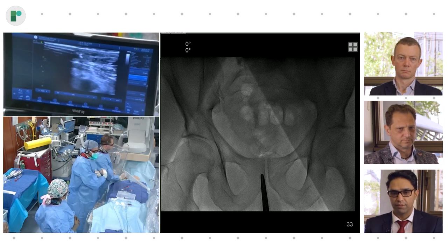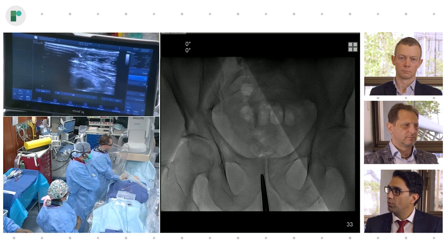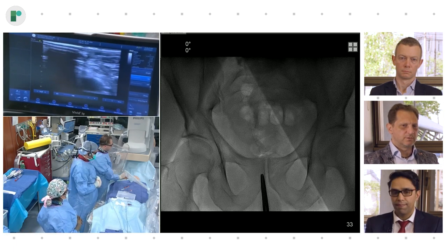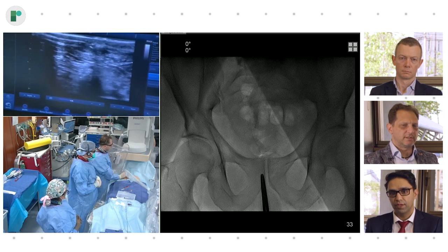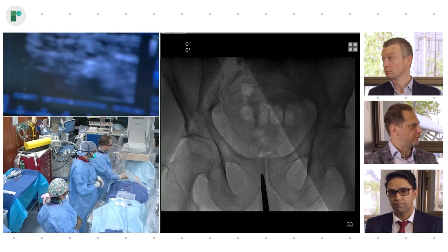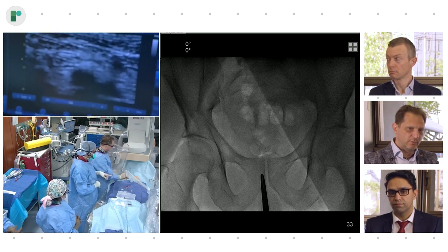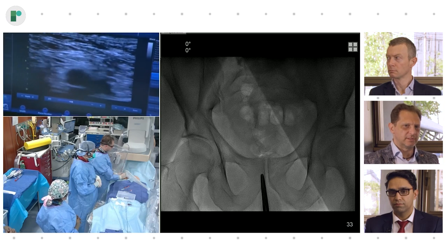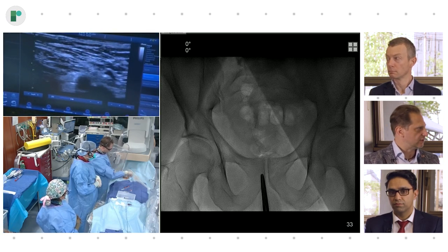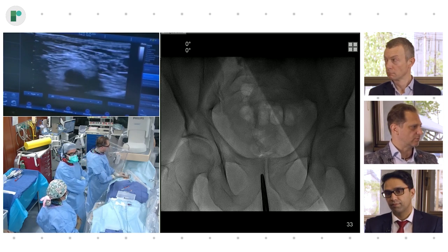The puncture, and use the two French dilator to actually enter the artery. Want to talk about how we do micropuncture access with the two French dilator? Yeah, so just to be certain that we're in the right position, we actually don't put in the four French micro sheath. We only take the dilator. And then we usually take a small puff with like 1 cc of diluted contrast to make sure the access is in the right place so we can close it.